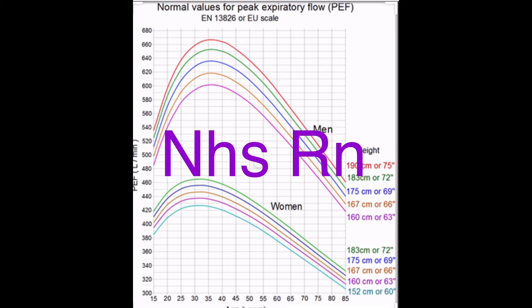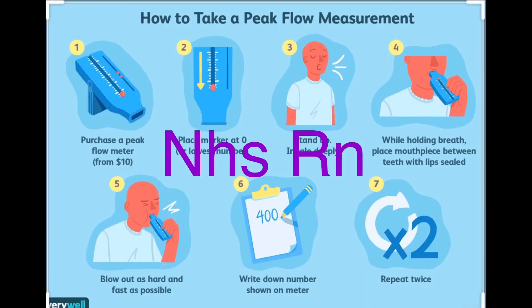Once the patient understands, ask them to do it three times. Each time, the examiner will move the gauge and give it back to you. Read the result, write it down, then reset to zero before returning it to the patient. Always make sure the gauge is back to zero before asking the patient to blow again.